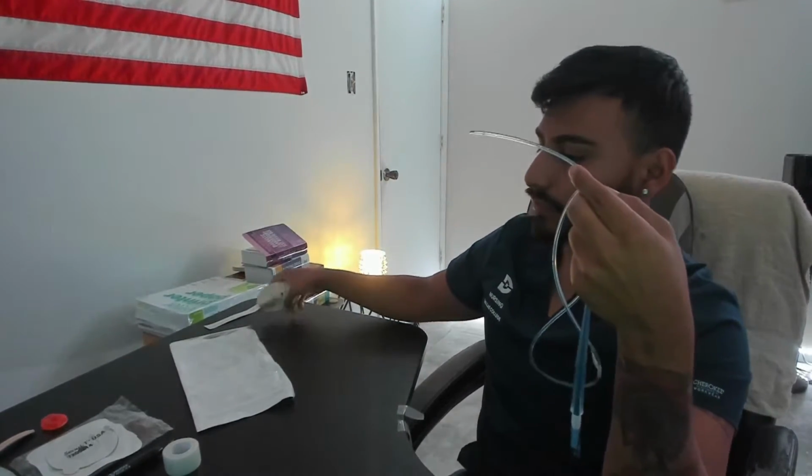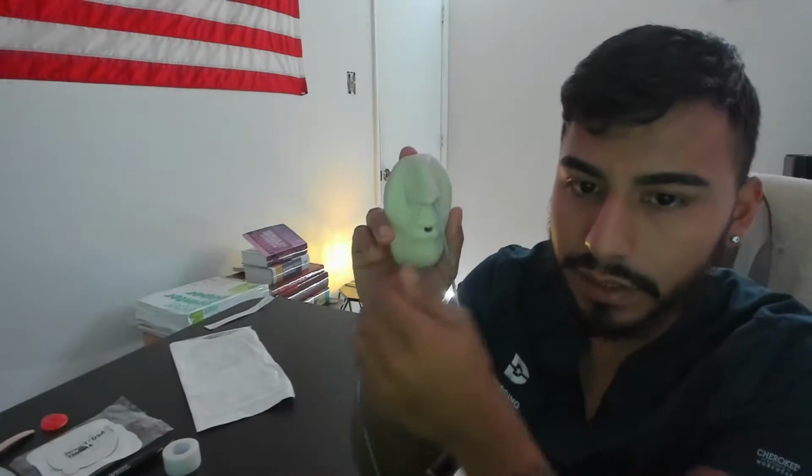So here we go. Go ahead and stick it in. All right, Mr. Buzzard, we're going to go right in. Do it quickly, smoothly, and as gently as possible. The patient tucks their chin in, and we go in all the way until we reach that mark of the tape. We have that tape mark right here.